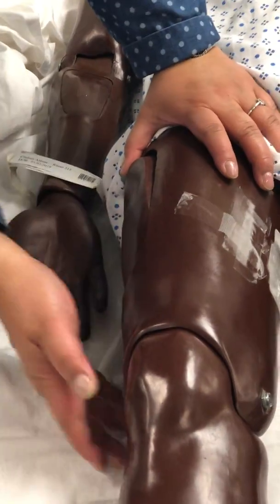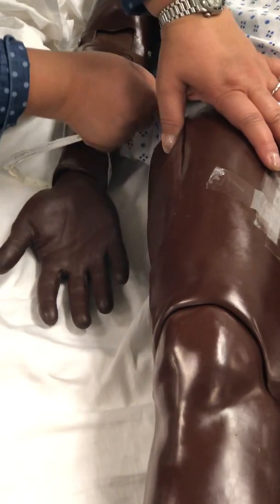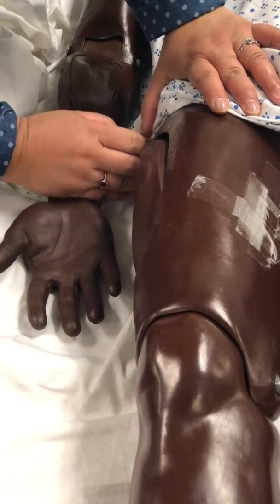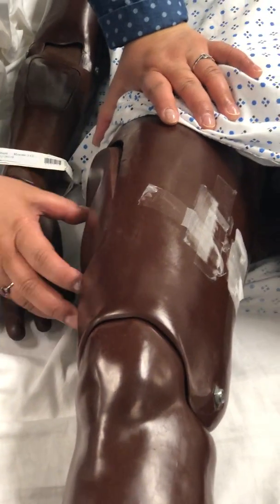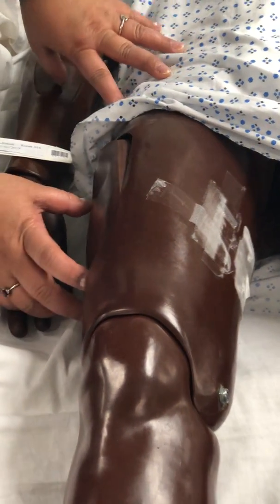All right? So, vastus lateralis between the greater trochanter and the patella, you're gonna divide this into 3 equal parts, and we go in the middle lateral. All right?